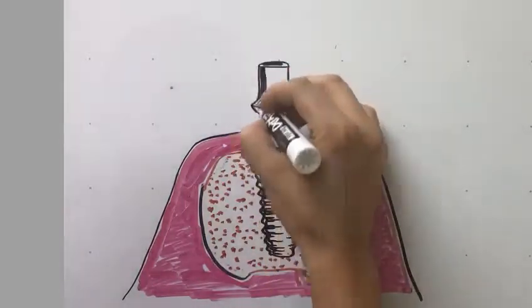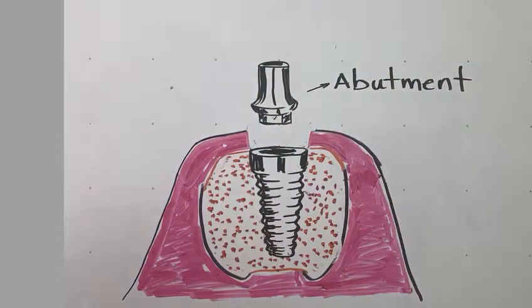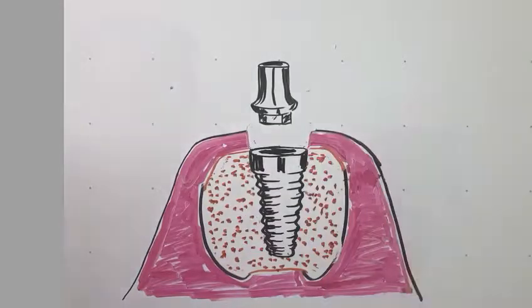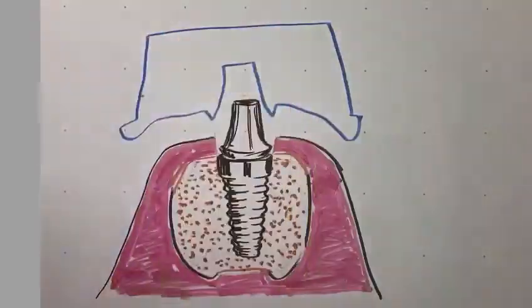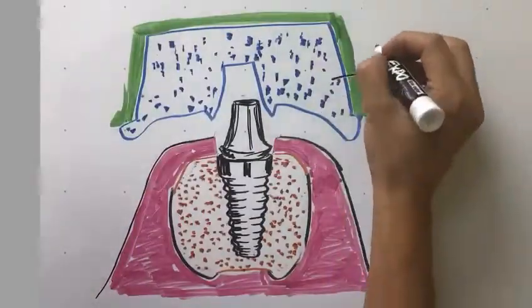After a few months of healing, the part that connects the implant to the crown or bridge, called the abutment, is placed on the implant. A copy is made of this abutment to make a restoration that will be permanently attached to the implant.